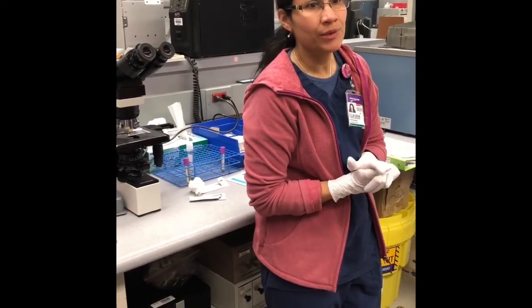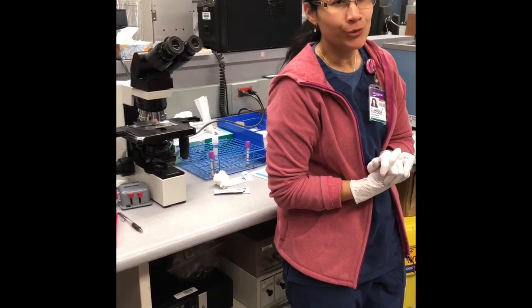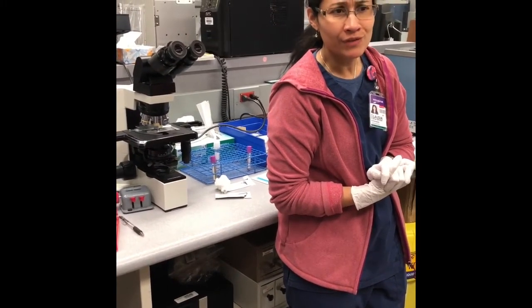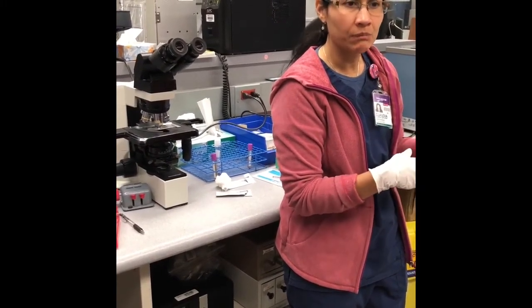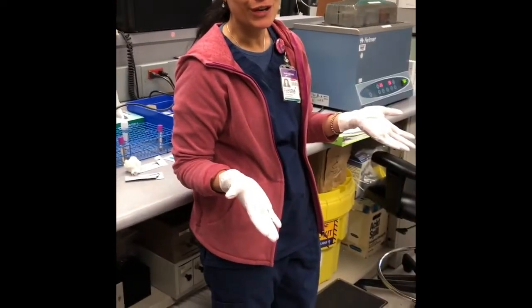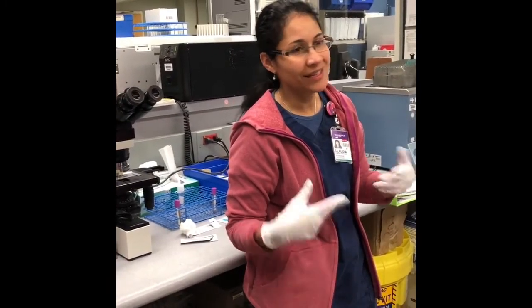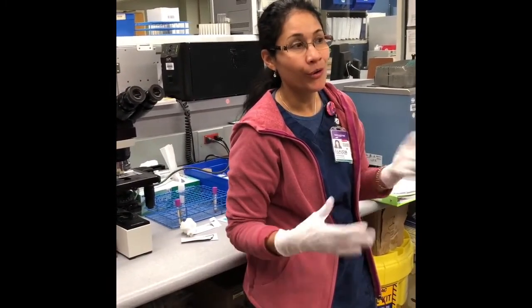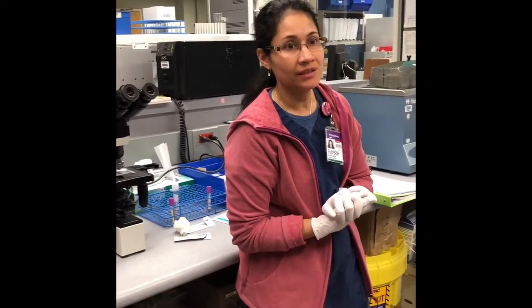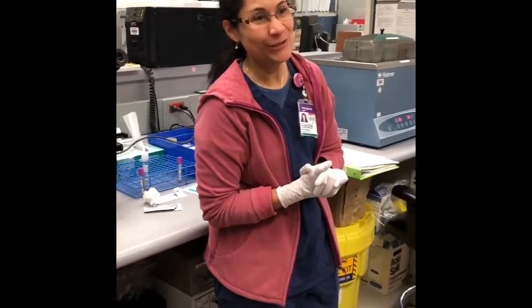Yeah, because when you get a white cell count of a total of 2 cells and you do a differential, you're going to see only 1 lymphocyte, and that lymphocyte will go to 100%. So you end up having 100% lymphocytes with like 2 cells. Some of the doctors say, okay, ignore that, but others say, oh, this is viral meningitis. And then they go, why did you do that to me?